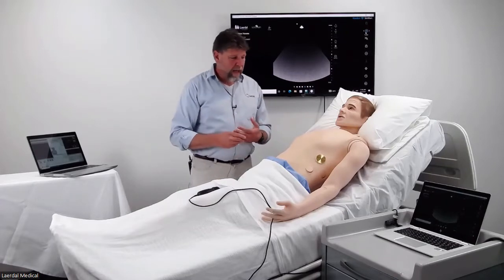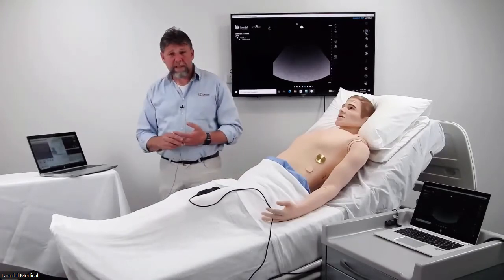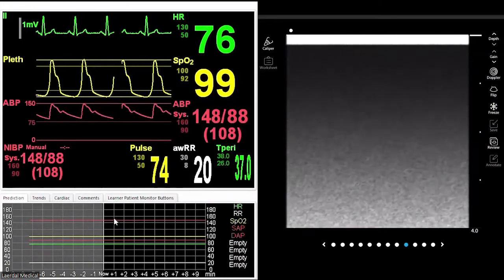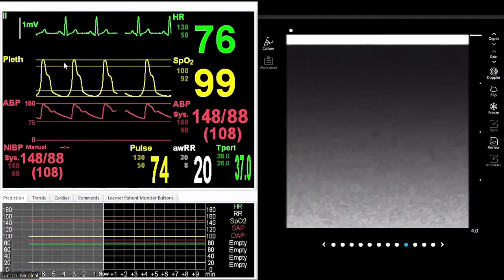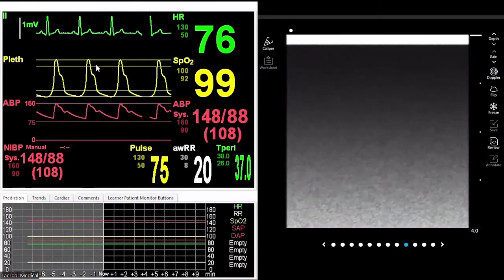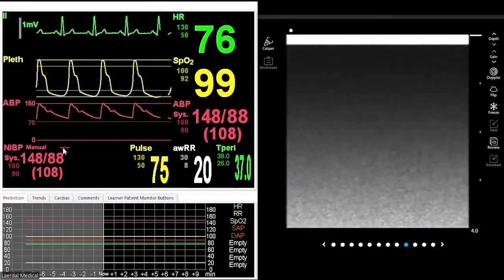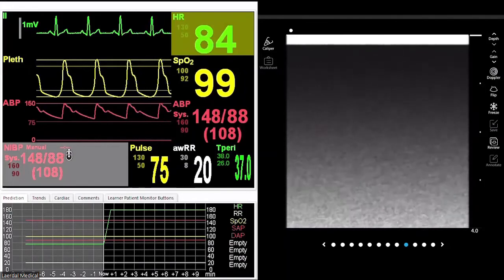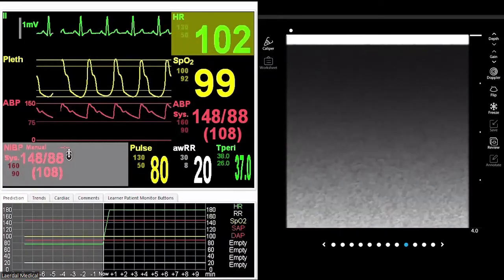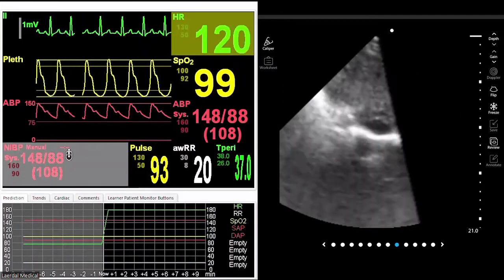So now let's have a look at how we can manipulate both the heart rate and the respiratory rate. To do that, we make the changes on the Leap PC. Currently the heart rate is running at 76. If I click on that numerical value, that will bring up the window where I can change the heart rate. If I slide that up to 180, set that to trend over a period of 40 seconds, and then select OK, we can see on the interface that we now have that trend running. If I come back with the ultrasound probe and acquire the image of the heart, we'll be able to see that heart rate increase up to 180 that's set on Leap.